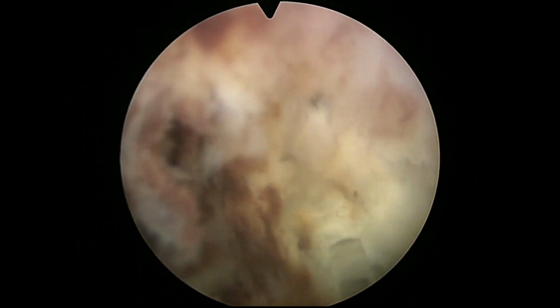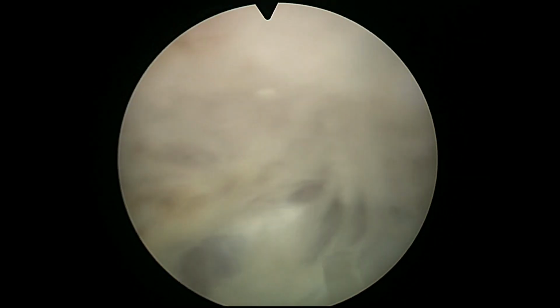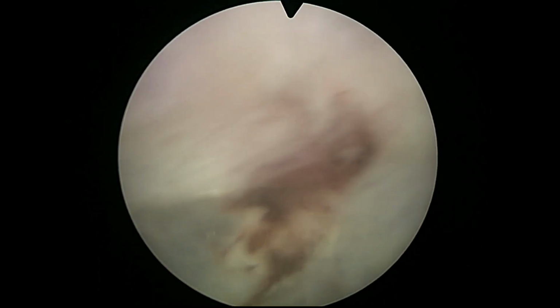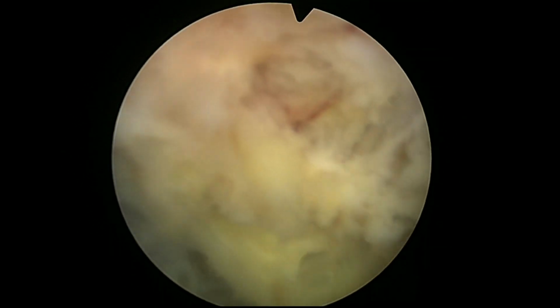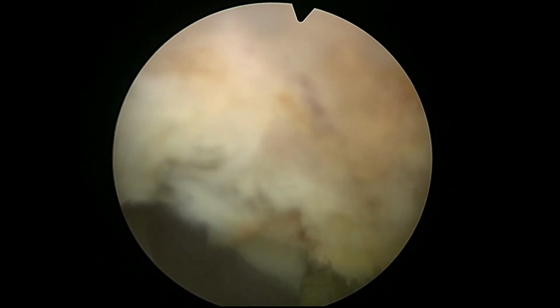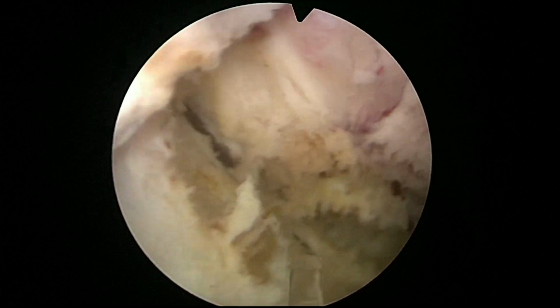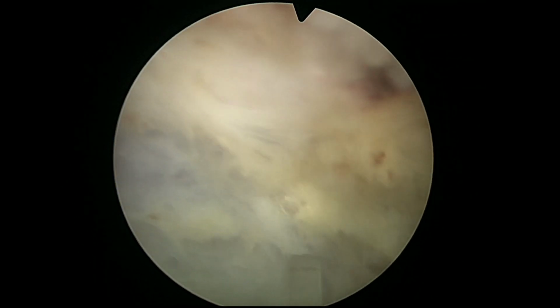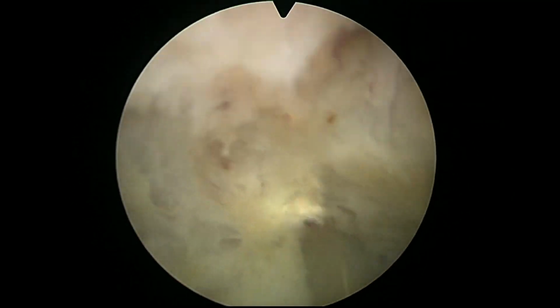To me, these are interesting cases. They make the operation a little bit more difficult and more challenging. So I probably wouldn't recommend for beginners to start with this kind of operation. But if you do HoLEP regularly, I think you will find that most often, I would say always, in my experience, you can find a plane. Maybe it's not the best plane in the world. Maybe the plane doesn't exist anymore, that's why you don't find it. But you can do a cavitative technique, applying the same steps that we usually apply for the early apical liberation and the sphincter mucosa protection. I haven't seen incontinent patients so far. So here you can see the dissection of the posterior plane.